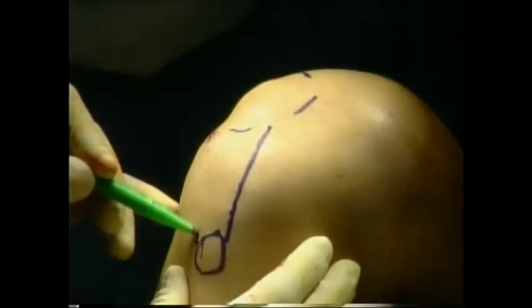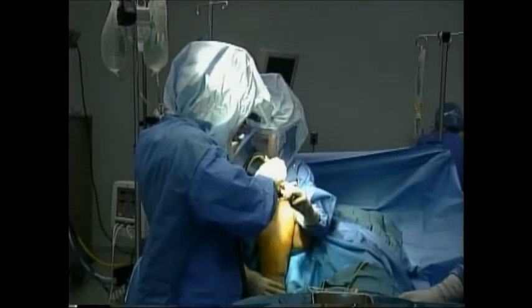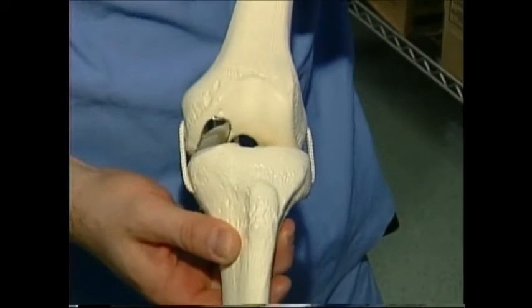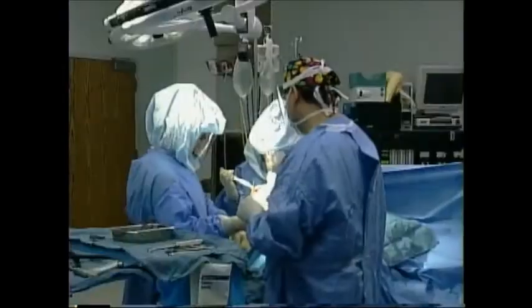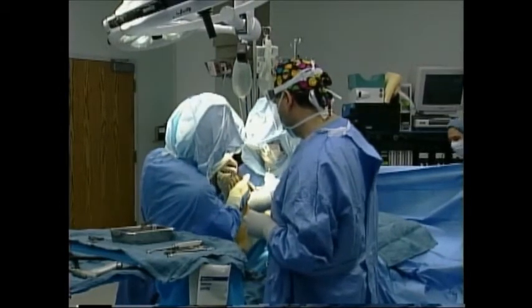Then he makes a small incision in the knee to allow him to see the bone. Next, he carves out a small area of the bone. As this model shows, it will allow him to implant a small piece of chrome and a separate piece of plastic in the place that Levy's knee needs more support.